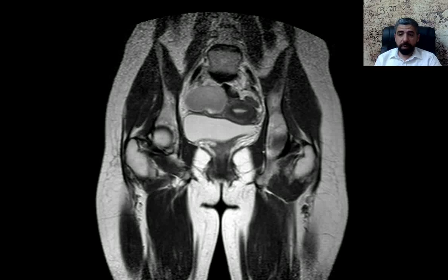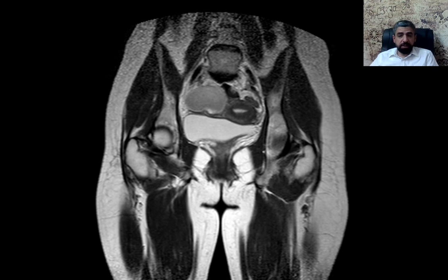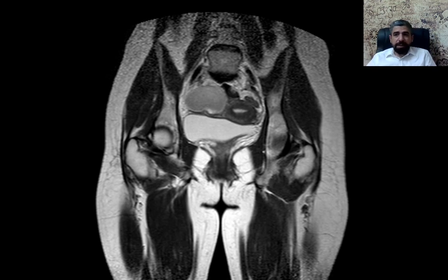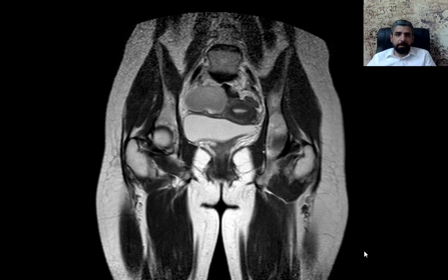As-salamu alaykum wa rahmatullah. I am Dr. Rahmadi Abdulluhaab, a Diagnostic Interventional Radiologist working in Arbir, Iraq. Today we will have a relatively simple case of MRI of the pelvis in an 18-year-old female patient presented with an abnormal pelvic ultrasound.